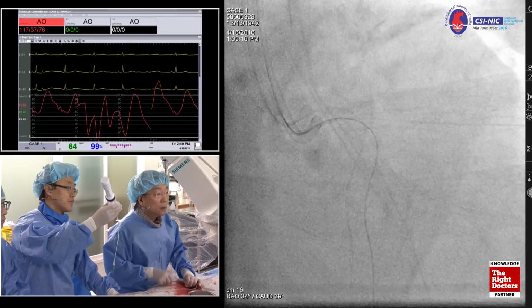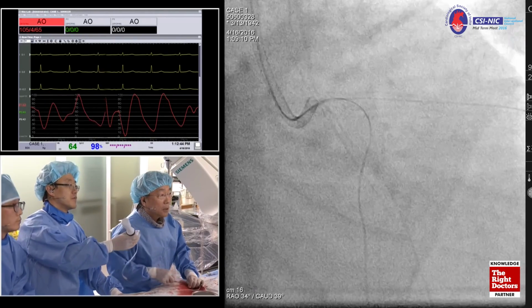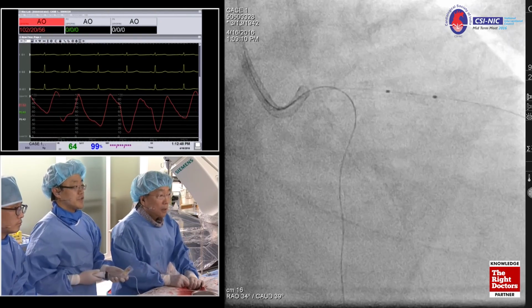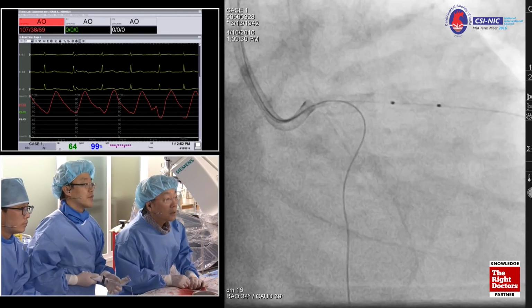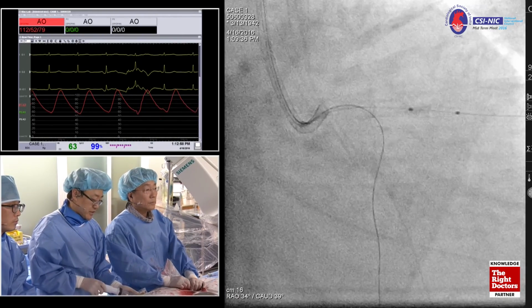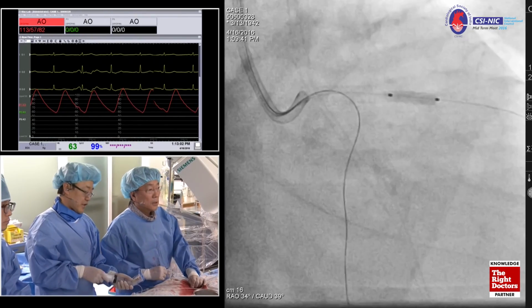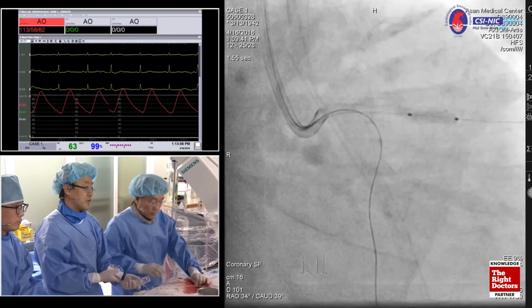So we can clearly see the LAD stenotic lesion. Okay, here we are. This is the 2.75. I just want to see where the balloon is. Okay, we can clearly see that here. Okay, nominal inflate. 6, nominal 6. 6, 7, 8, 8. Just 8. 2.75, right? Yes. Okay, so deflate.